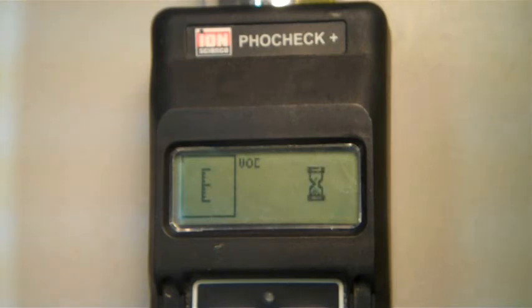If the span calibration is successful, you will see a check mark. Before removing your Tedlar bag, we recommend that you perform a functional bump test. This will confirm that the unit is calibrated and reading accurately.